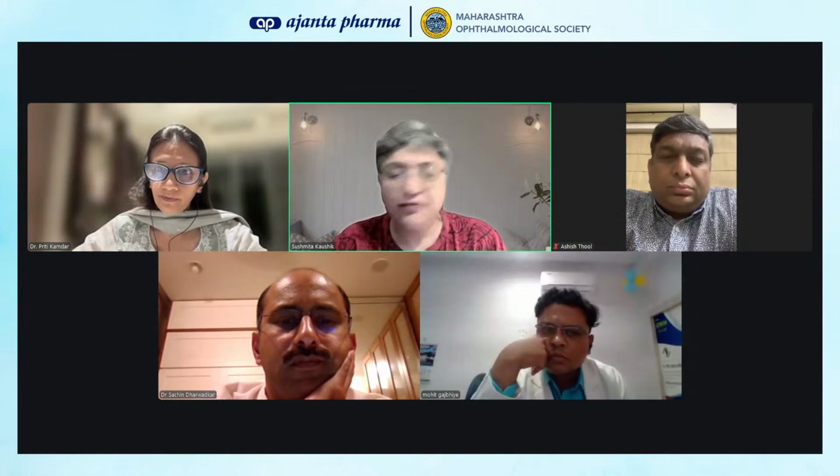So the limitation is that the machine isn't very robust to hold too many examinations and the analysis doesn't happen. So it's a bit of a hassle to go to the server, tell your IT guy to pull back these examinations, then do a progression analysis. And it's okay if it's not a very high volume practice and you can get that.